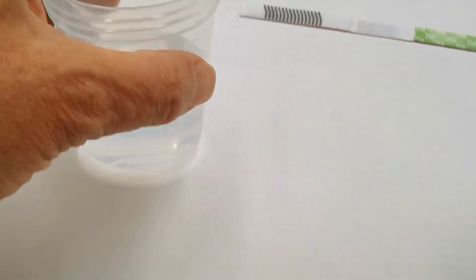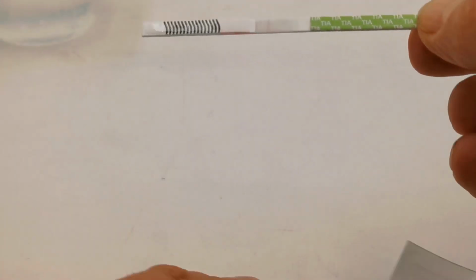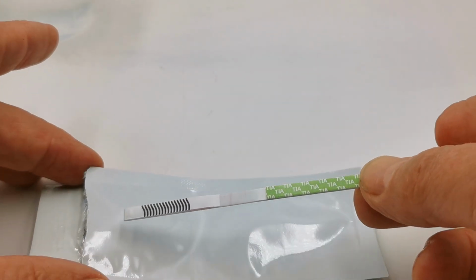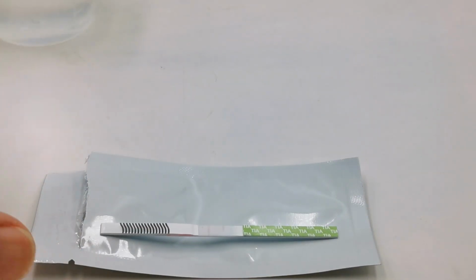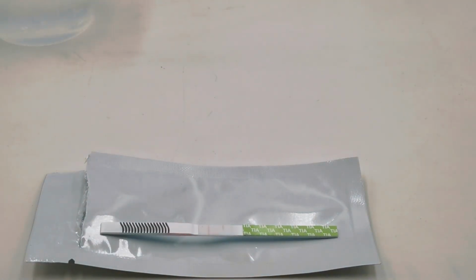Remove it from the liquid, tap any excess off, and then you should lay the test strip onto a flat non-absorbent surface. Best thing to use is the reverse of the foil you've just removed it from. Correct read time for these tests is between 5, 8 or a maximum of 10 minutes. For negative results, they can be read pretty quickly, as you can see what's developing there, but we will come and refilm this at 8 minutes.